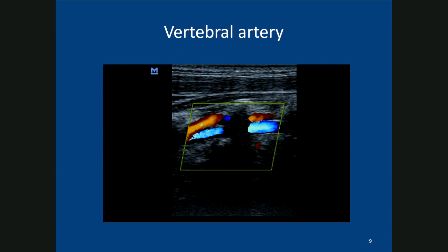Well, this is a good time to give you a little lesson on color flow. Let's say we had a color map, and the top of the map was color-coded red, and the bottom of the map was color-coded blue. If you remember from physics and also from last month's class, we talked about how to read the color map, and we said that the color on the top is always the positive color flow assignment, and the color on the bottom is always the negative.